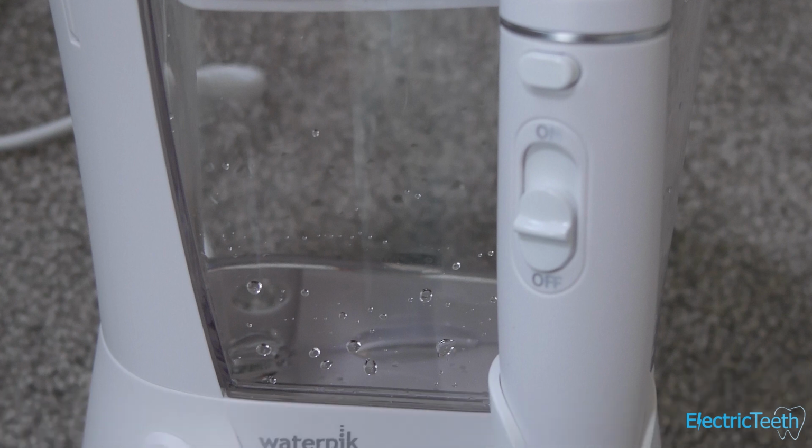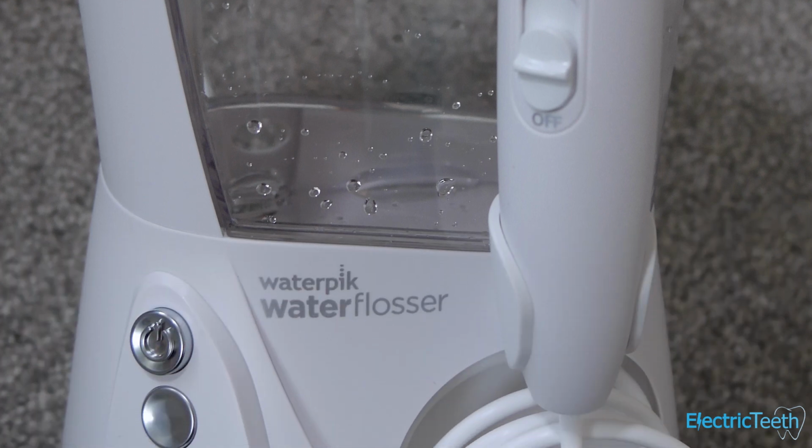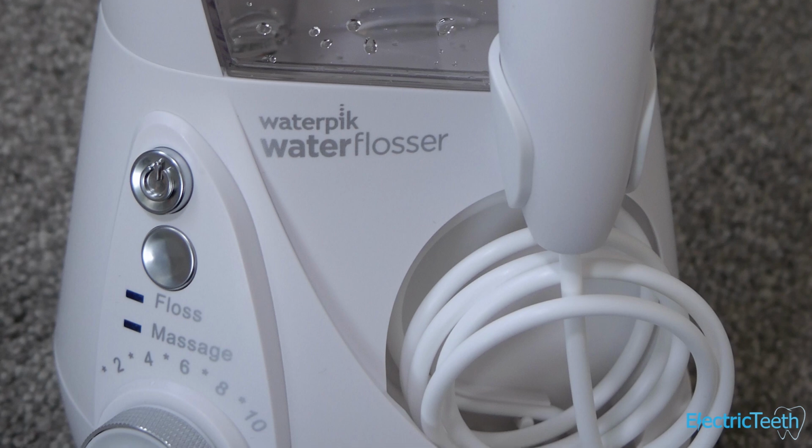It does need to be connected to mains power to work. There's no battery or anything built in. When actually running, it's surprisingly quiet, a lot quieter than older models, and although it does make a noise, it's quieter than I had anticipated it would be.